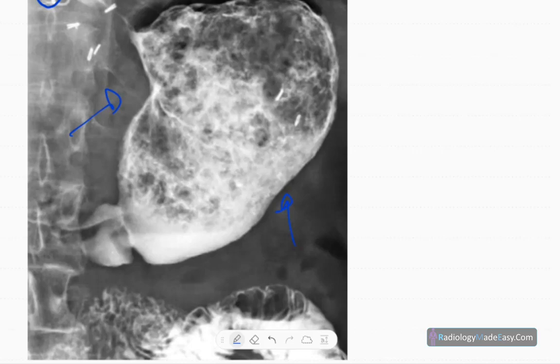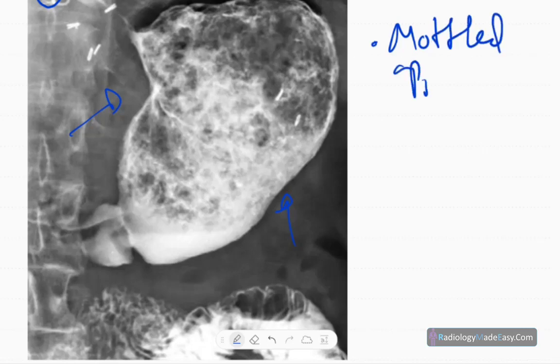There's a mottled appearance. However, the outline is normal, regular outline is seen. There are dot-like appearances and some intermittent dot-like filling defects. You can see multiple dot-like filling defects and it has a mottled appearance.